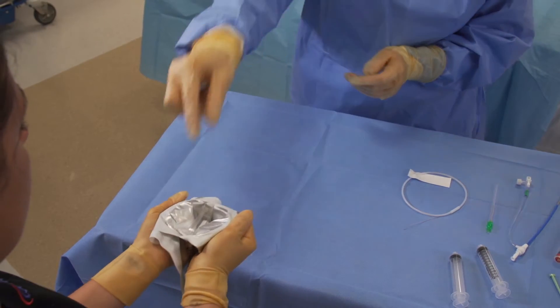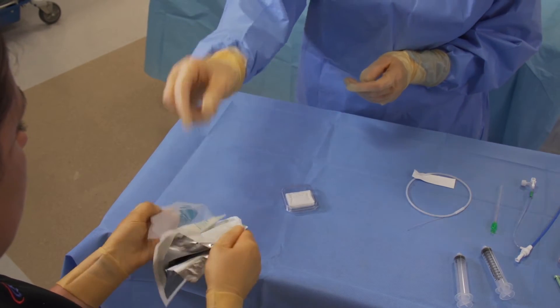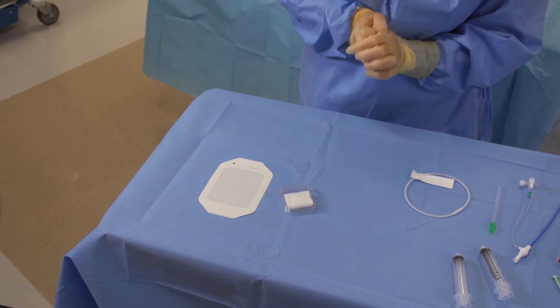First, remove the hemostatic pad from packaging and place the pad into the sterile field using aseptic technique. Do not wet the pad with saline before using it. Use as is.